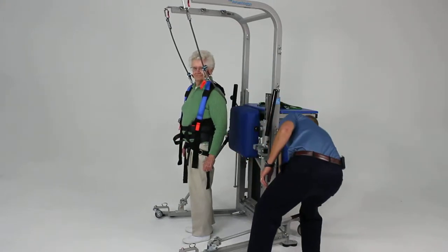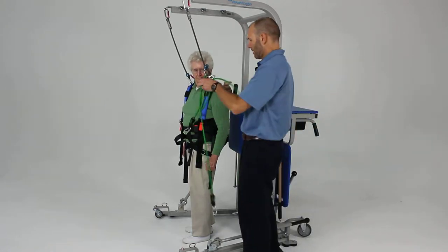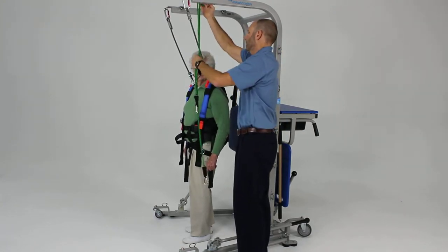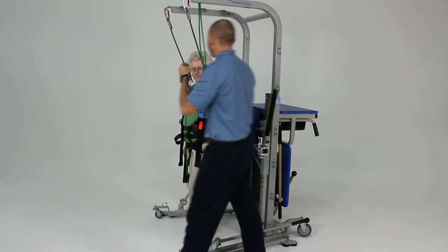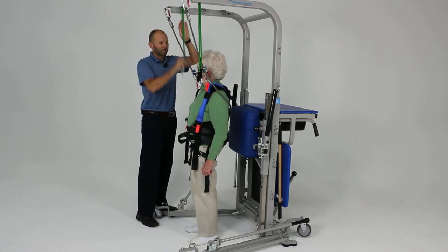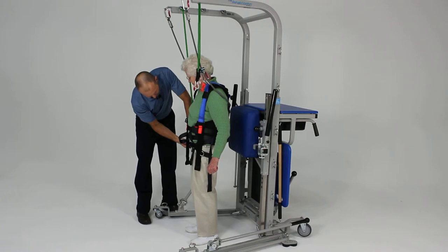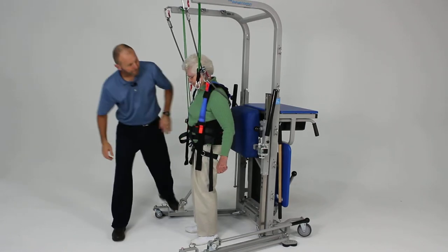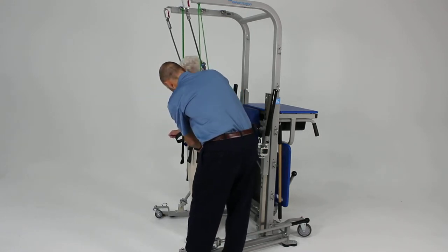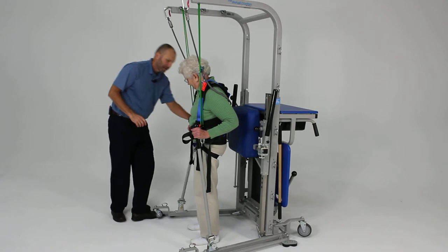Now we're going to do a little plyometric activity. We're going to take some elastic cords and do a girth hitch to get these in place — do the same thing on this side — and hook these down to our D-ring on the pelvic loop, the pelvic strap. And we're going to give you back your activity poles.